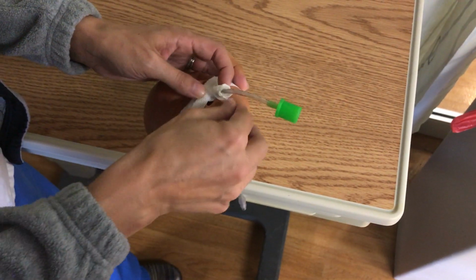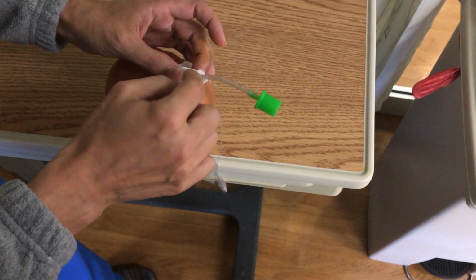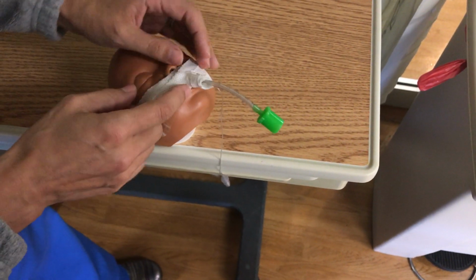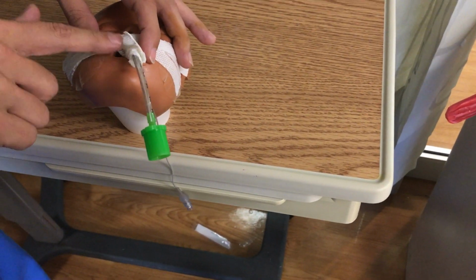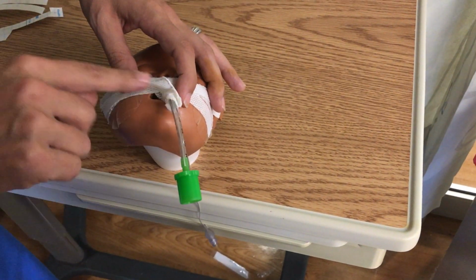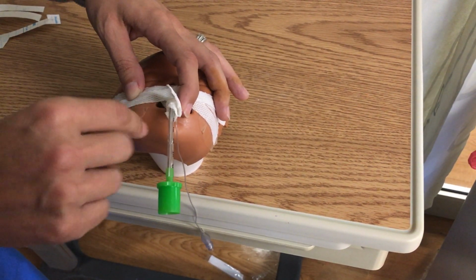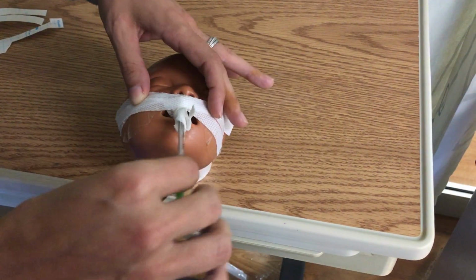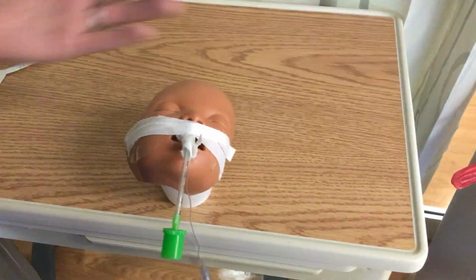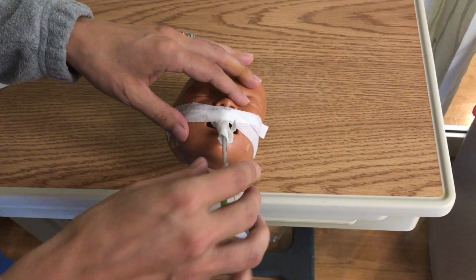And if you just go around in a circle and don't really spiral up your tube, then what you're creating is just tape on top of tape. So you, again, don't have the multiple contacts between tape and tube that provide for your ET tube security. And I'll do another big courtesy tab there. So not only does this not look as pretty, but it's really not as secure.